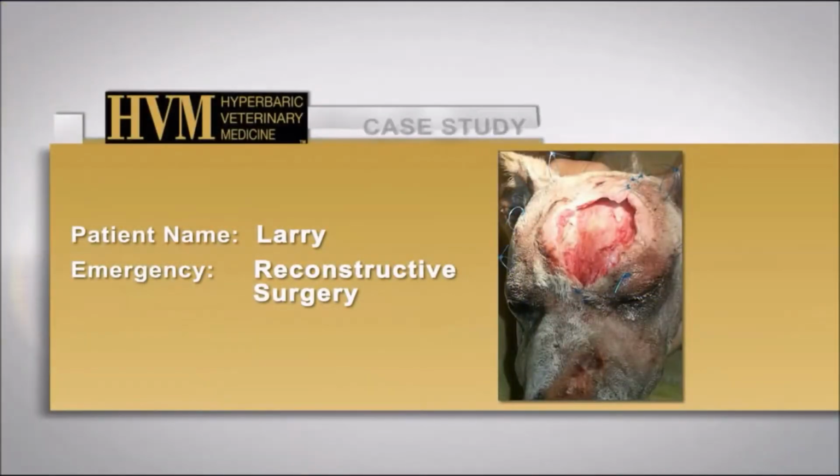Here, what we've done is we've combined all our surgeries to go pretty much through the hyperbaric chamber, particularly all the flap surgeries. So we have a dog named Larry that had a completely scuffed top of the head from having a car run over his head. And he was very lucky because his damage was mostly skin and muscle trauma. We went ahead and did all the preliminary care and then flapped his injury to go ahead and cover all his bone of his skull. And Larry healed beautifully with absolutely no complications subsequent to going to hyperbaric chamber therapy because of the oxygen therapy promoting the healing, the clean up neutrophils, and making things a lot easier for the surgeon to work with.